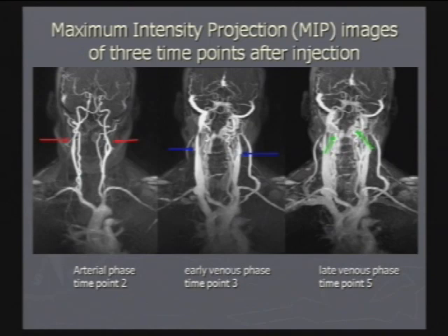In the middle image, you start to see this confusion with the veins. You also see these upper level narrowings in this case. And these are the ones that Sal is suggesting actually may come from a problem that is occurring at the confluence of the jugulars with the subclavian and brachiocephalic.